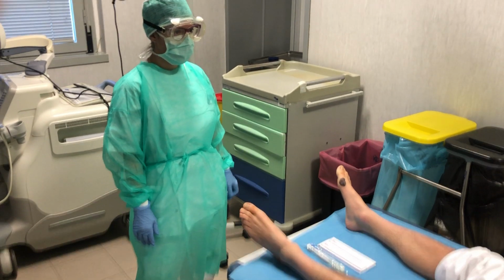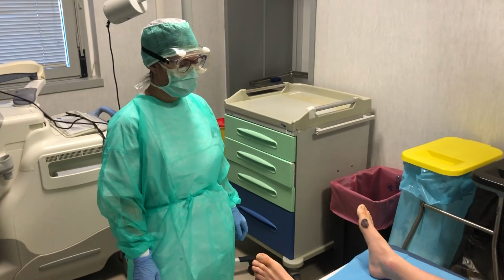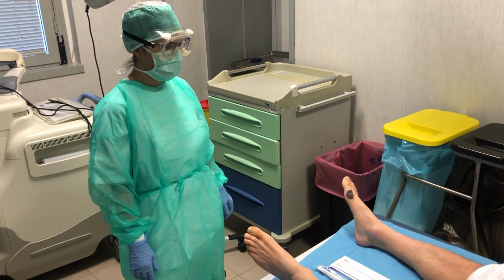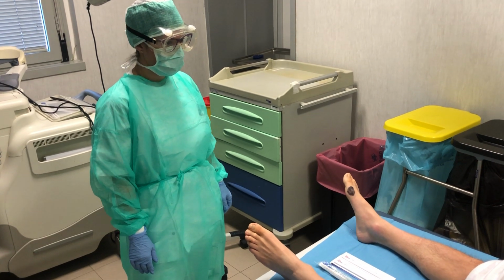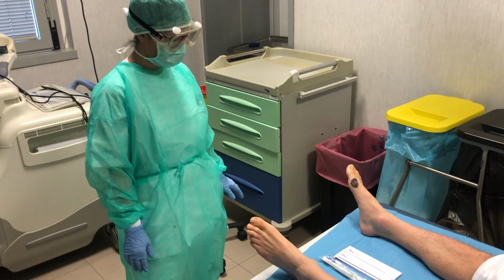This part of the tutorial is dedicated to the imaging of the lesion that we have to perform any time the patient comes into the clinic, because we want to record the situation and the dimension of the lesion.